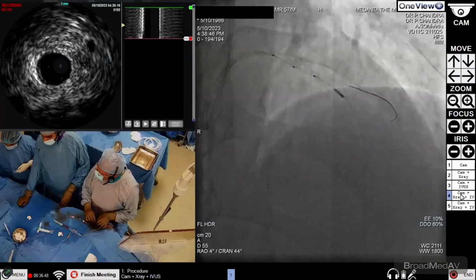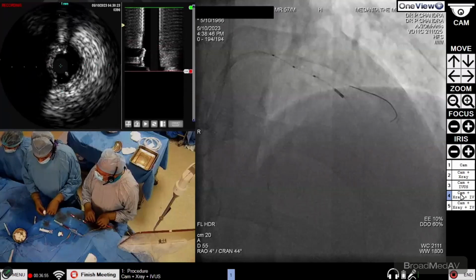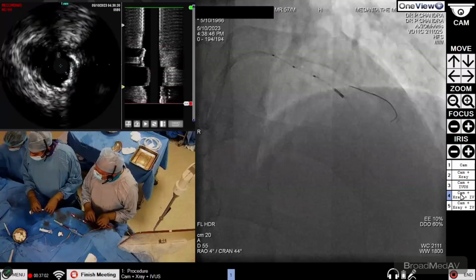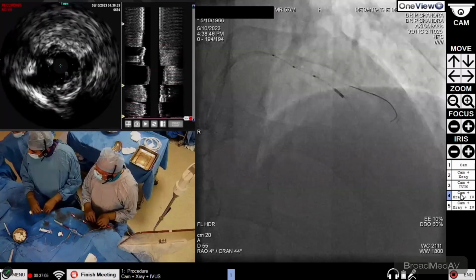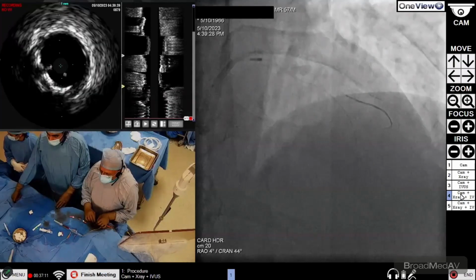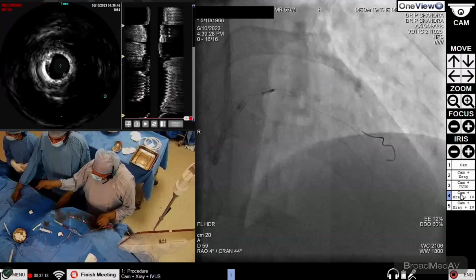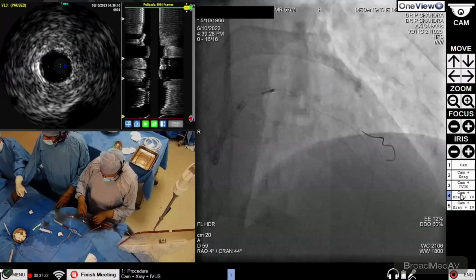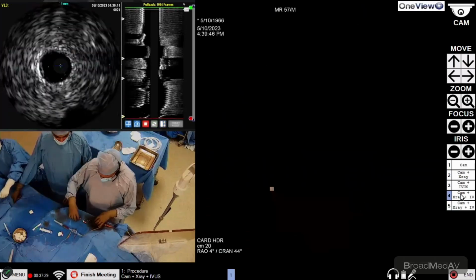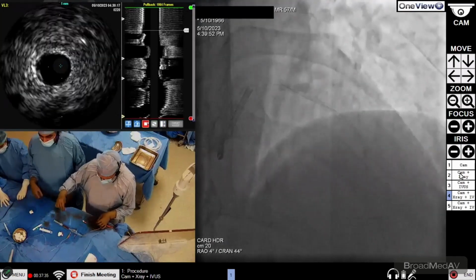So the distal vessel is looking almost like 3, and yeah, you can see the disruption of the calcific plates, and also at this point there is a fracture in the calcium, and this is looking quite okay. Okay, fine. So you can review the IVUS now. Play. Yeah. Distally, it is around 2.6 maximally. So this doesn't seem to be working now. No. Okay, we'll take it out.